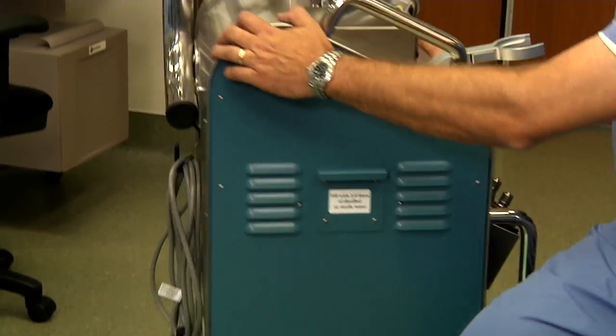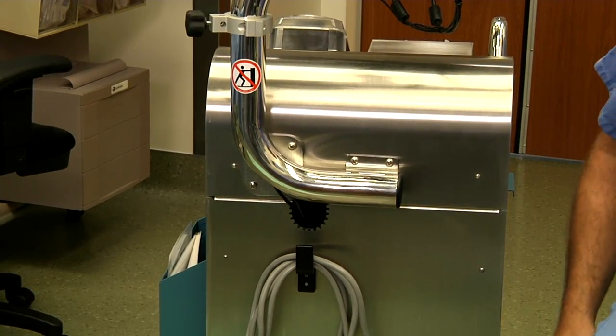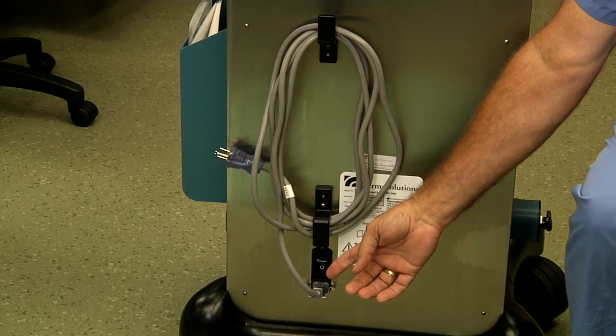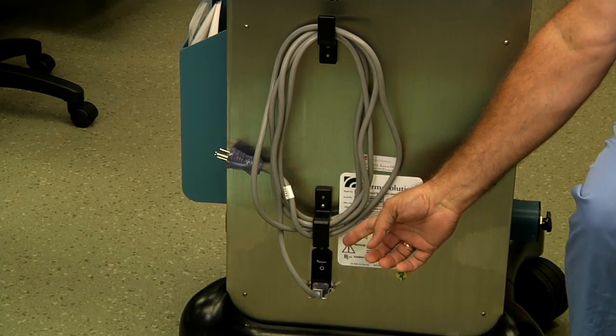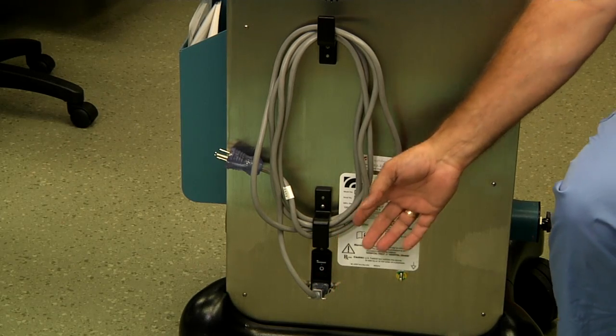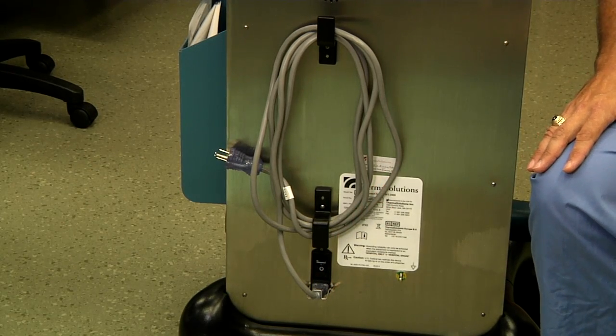On the rear of the HT2000 we have the power cable, and located directly above where the power cable comes in is the power switch. This is what we utilize to turn the power on and off for the device.